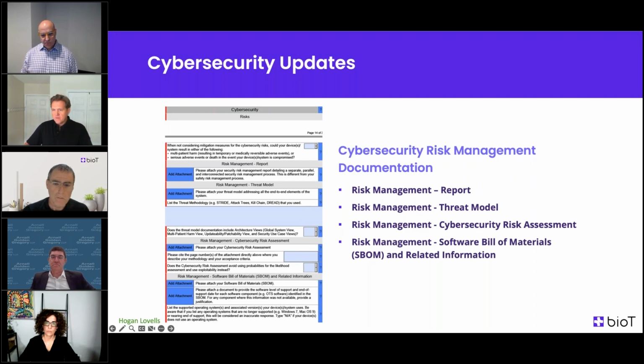They want architecture views, which is part of your threat model. They want to understand the trust boundary around your device and its relation to, say, the hospital environment. They want the SBOM. There's numerous tools out there, open source, that provide a very high-level methodology. There's a lot of paid ways that you can do it out there that maybe provide a bit more detail, but just do what works for you. Maybe we can go to the next slide.